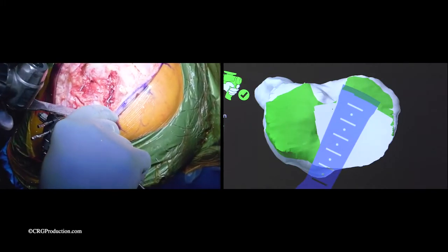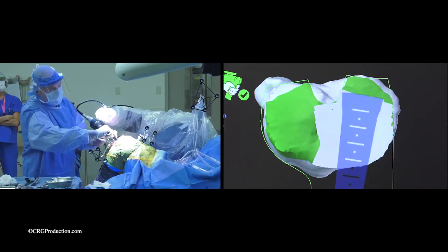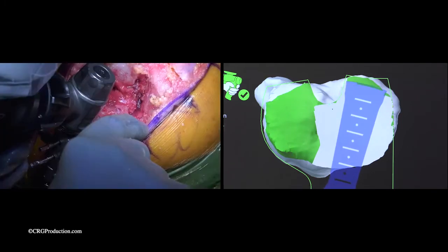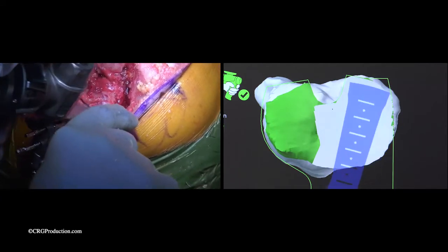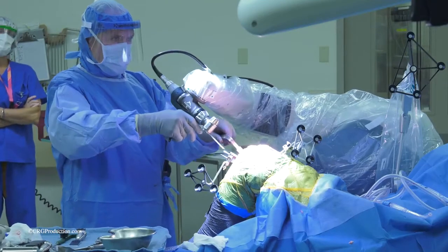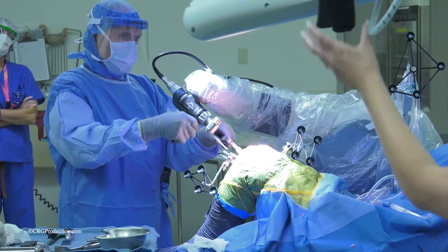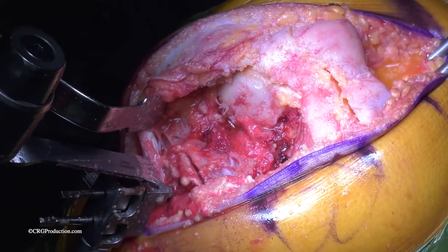Sometimes there are tight spaces and it takes a little bit longer. Sometimes the bone is incredibly hard. Because of the arthritis, it's called sclerotic bone. Sometimes it takes a little longer. It's best to get as much of the green color eliminated. The robotic arm just moves in position for the next side. You can see the retractor on your far left pulling over the kneecap tendon.